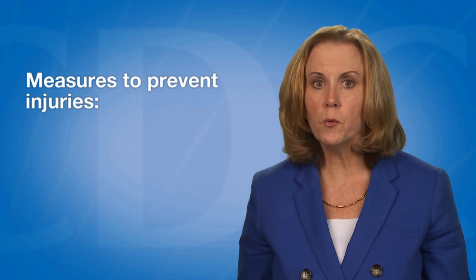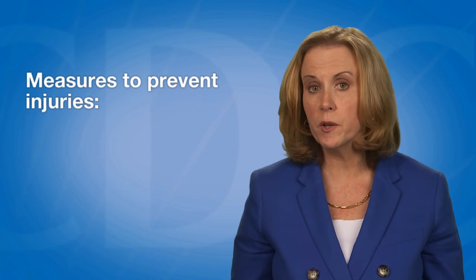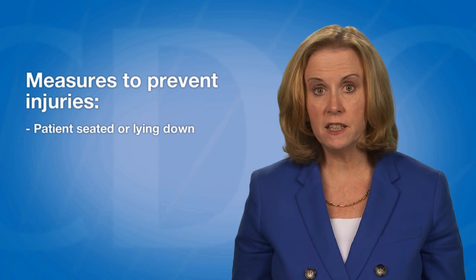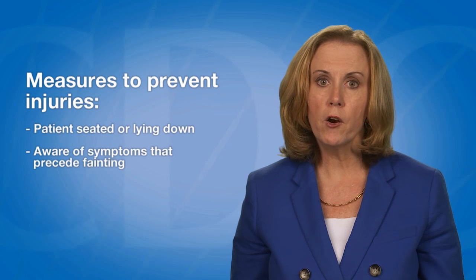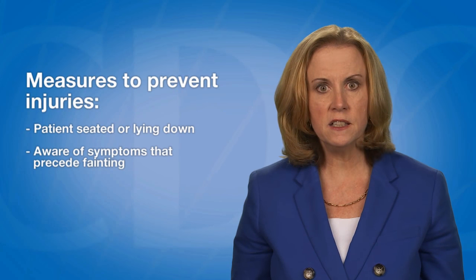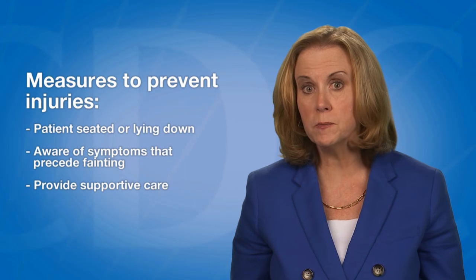Immunization providers should be aware of the potential for syncope or fainting following vaccination. Providers should have the patient seated or lying down when administering vaccines. They should also be aware of symptoms that precede fainting, such as weakness, dizziness, and pallor, and provide supportive care if symptoms occur.